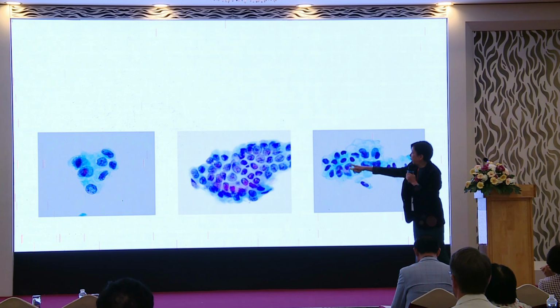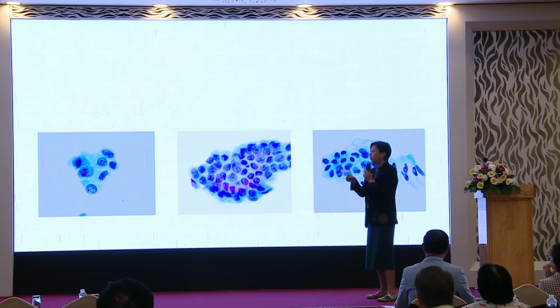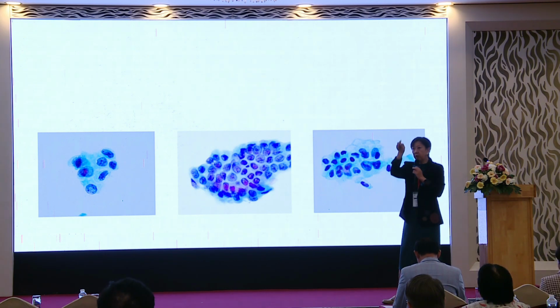So we thought this was unequivocally malignant. You can see the nuclear membrane. And last time we used to say, what do you mean by the cell is atypical and the difference in nuclear membrane? If you divide the cell into four, each of the four corners is different. If they're benign, usually you divide into four, it should be about the same.